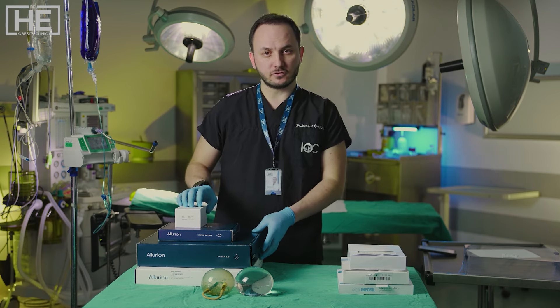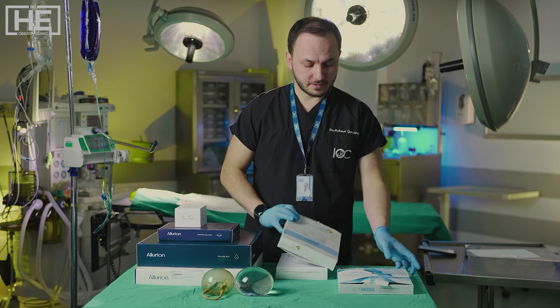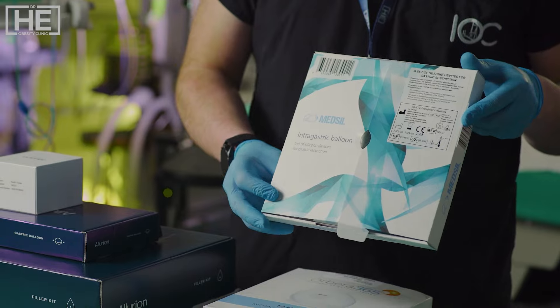Here we have the Allurion balloon, the Spatz adjustable balloon, Orbera, and the Medsil six-month balloon.